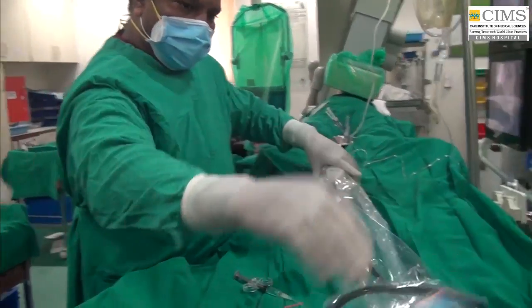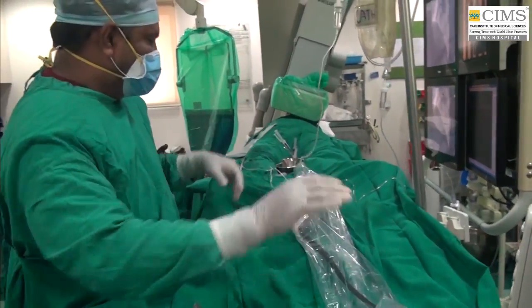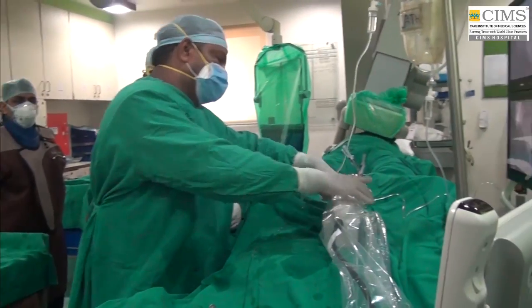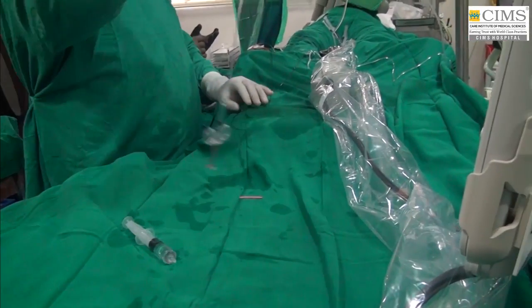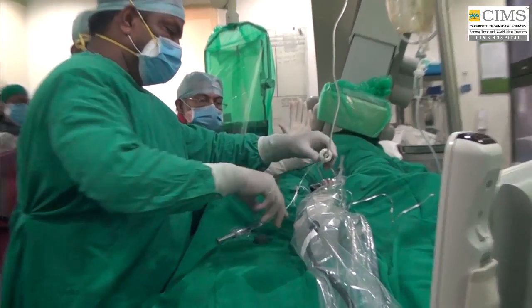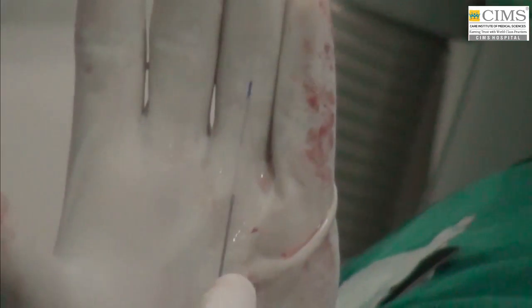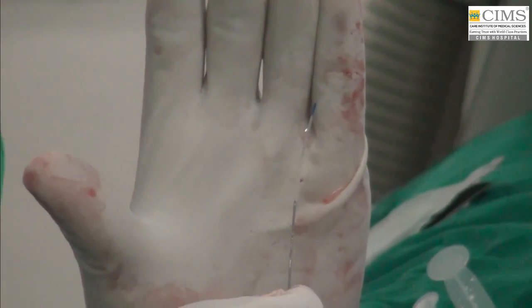So this is a dock. It's an intermediate dock. The catheter is connected to the dock through a magnet-like mechanism; it kind of clicks in. Okay. So we'll connect the OCT. We have already pre-dilated the lesion with a 2 millimeter balloon. And once the OCT is properly connected, the laser light will start showing up. So right now you see the OCT catheter, there is no laser light. And as it's being connected, the laser light will light up.